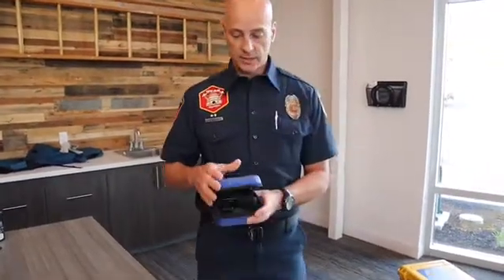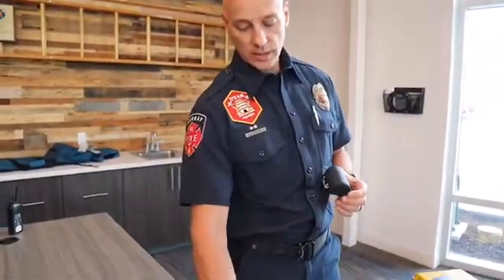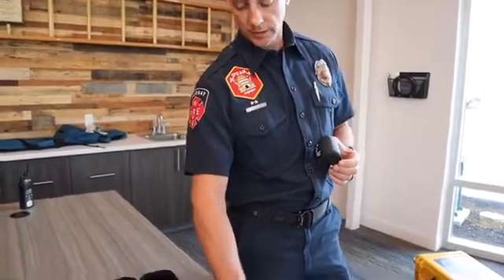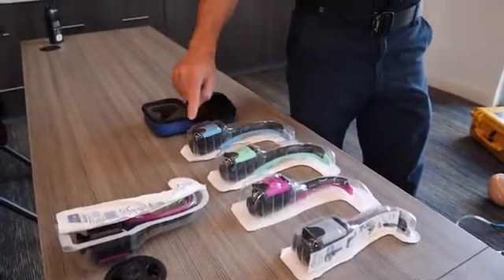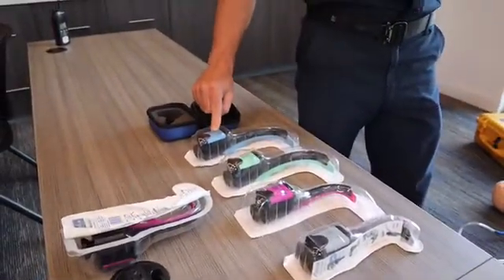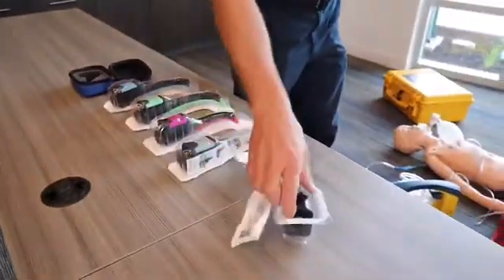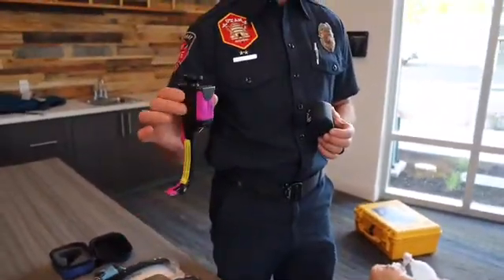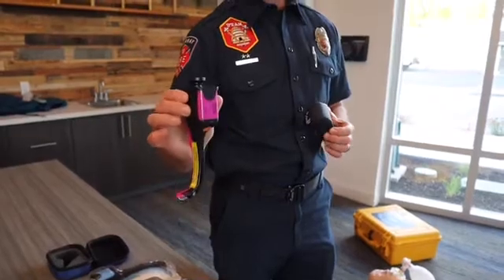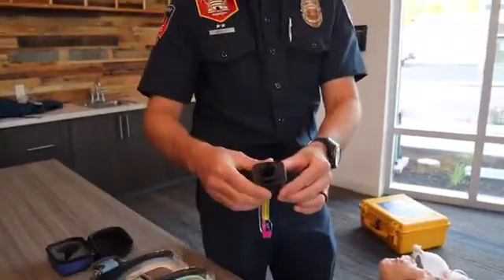The AirTrack is a video intubation device. This is the camera itself and the camera attaches to a one-time disposable blade. The blades are sized: this is infant, pediatric, small adult, and regular adult. For the purpose of the training tonight we're going to be using a pediatric blade, which uses an endotracheal tube anywhere between 4.0 and 5.5.